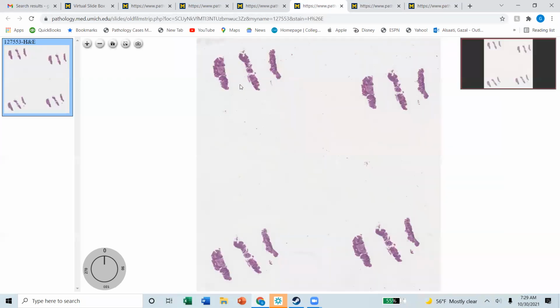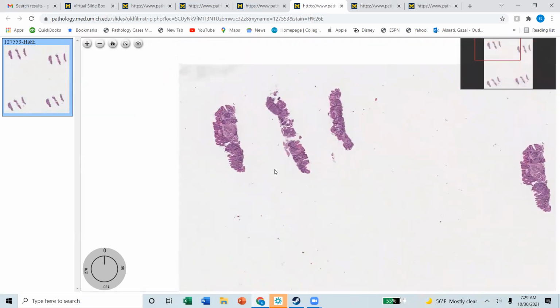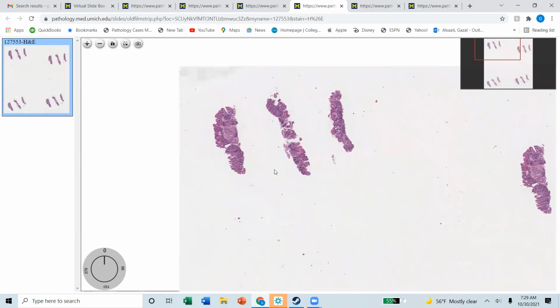Okay, so I don't know who was asking about the gastrin stain. Before we move on with our H&E, for patients with suspected AMAG, we will get an antral biopsy and a body biopsy. The antrum doesn't have oxyntic mucosa, and it is easy for us to call it antral if the doctor is calling it antral, and we'll call it antral type mucosa with reactive changes, and so on.